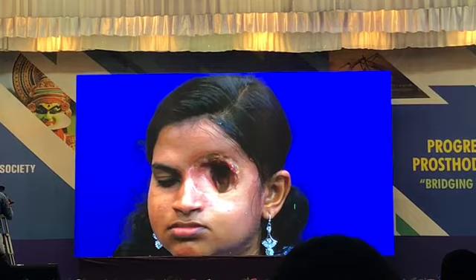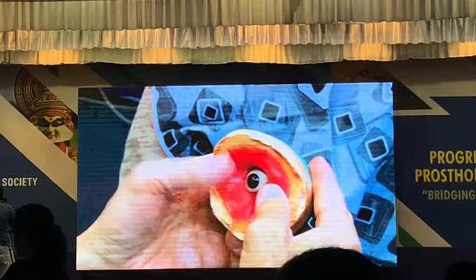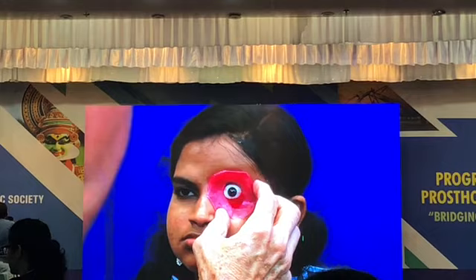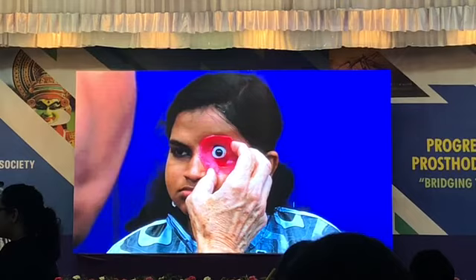You put it back on the cast, like this, and then move it out. When the wax is soft like this, you can move the globe around. And let's try it back on again. You can see here, it's starting to get into a better position. But it's still looking a little to the right and a little bit up. So let's move it again. You keep moving it around until, when she looks straight at you, the globe looks straight at you.